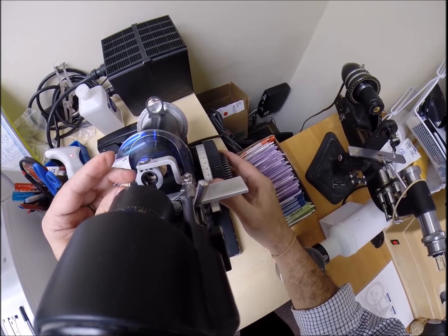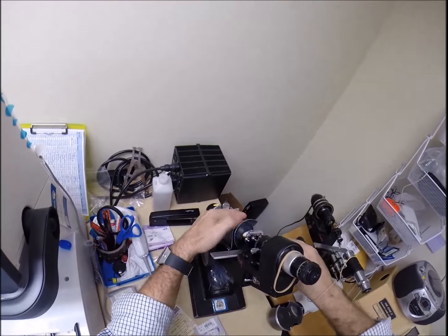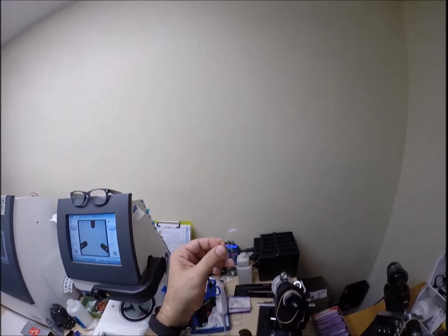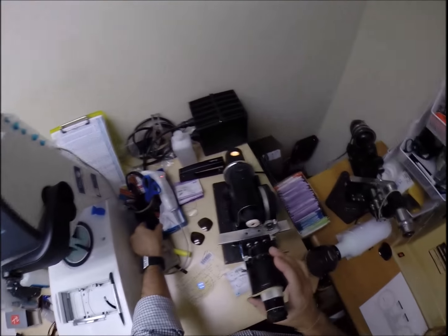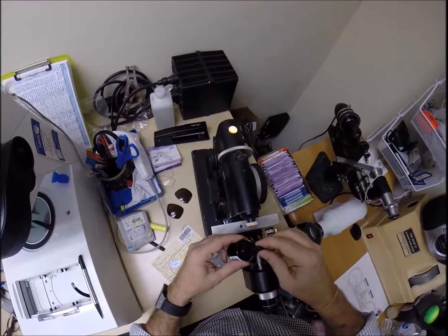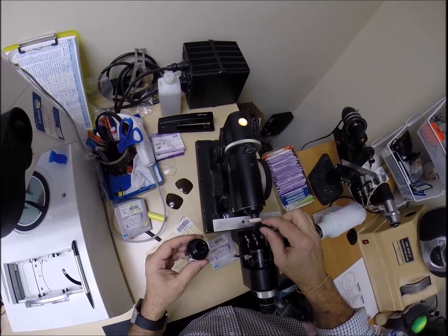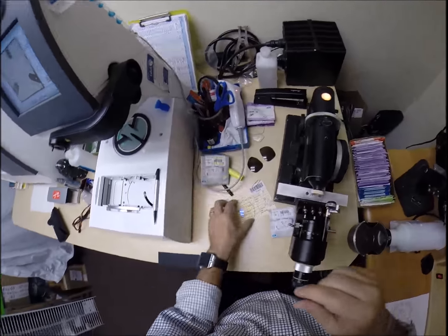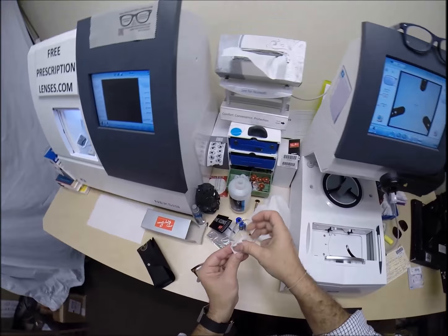Check your astigmatism correction. That lines up well. And I'm going to put 3 dots on your lenses. Come on, why didn't the center dot work? Let me put some ink in that center one. Come on, center dot. That's the most important one. Gotta have the center. Let me clean all this off.